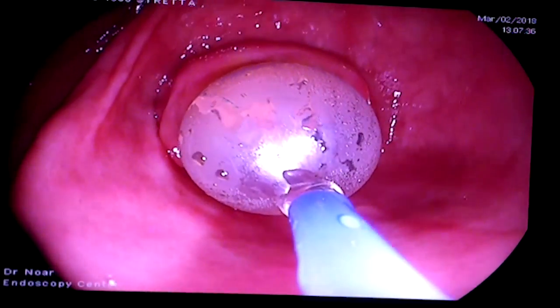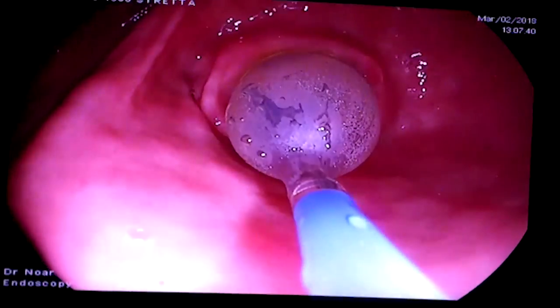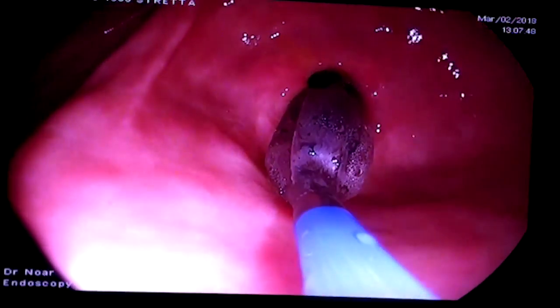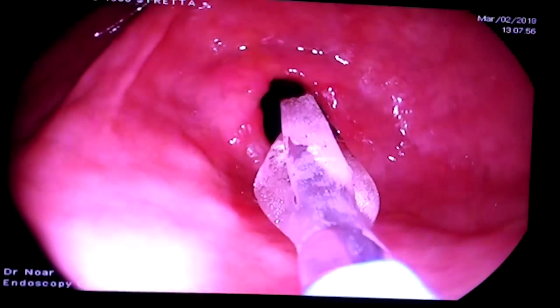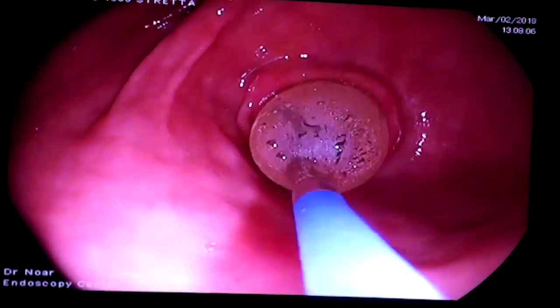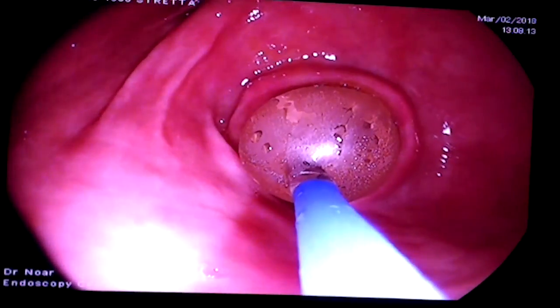We can look through the balloon and see the blanching of the tissue. We'll take the balloon down now, and we want to let it down far enough so that we can see around it and that we've got a good stretch. Then once we get that, we'll go ahead and blow it right back up again for two minutes.